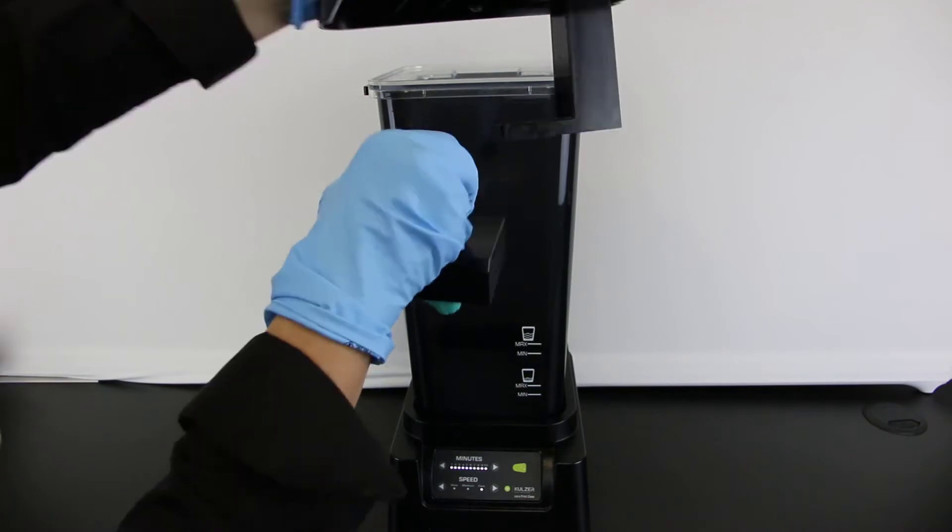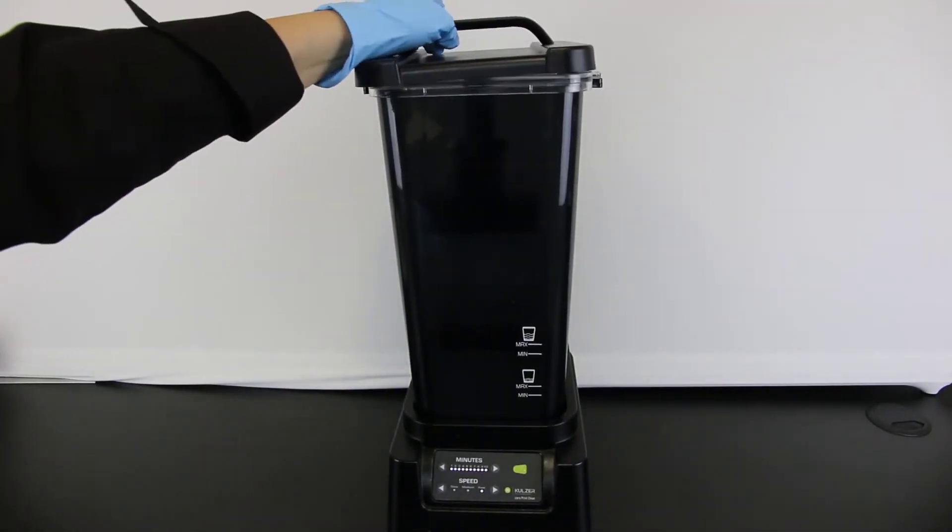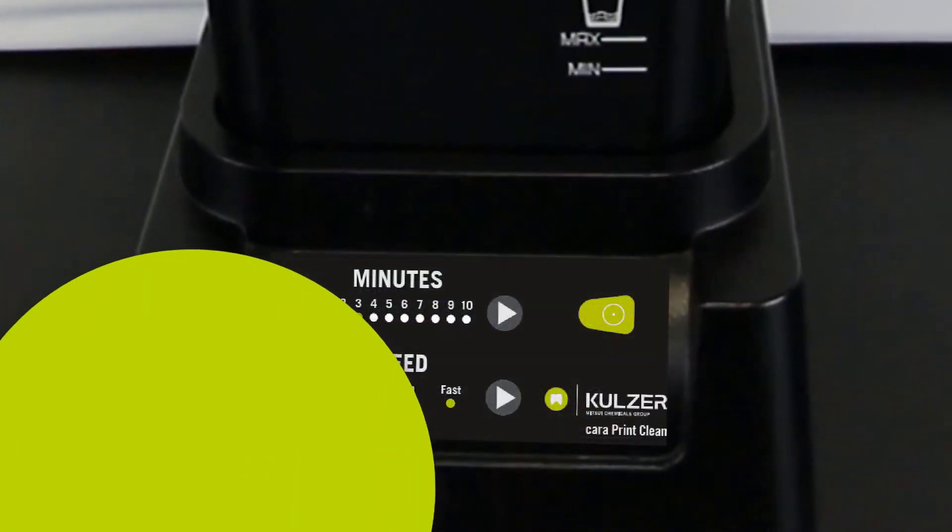Screw the printed object on the printing platform onto the large spacer in the lid of cara print clean. Start the first cleaning for three minutes.